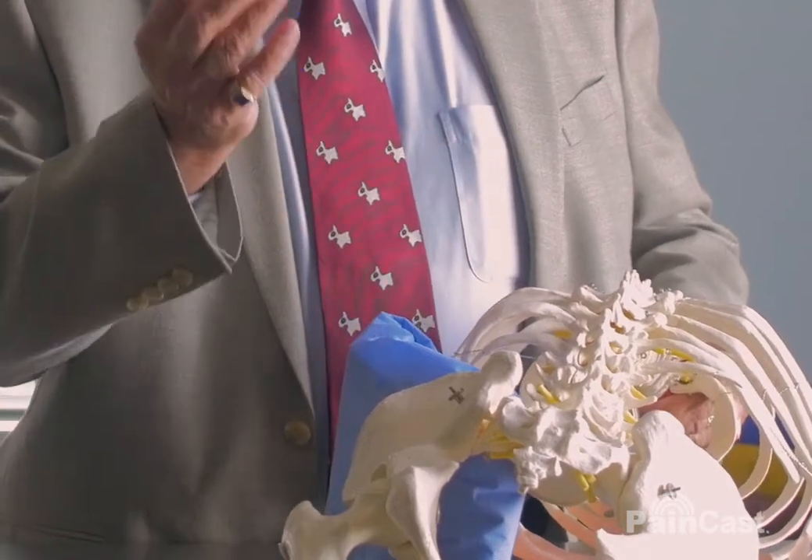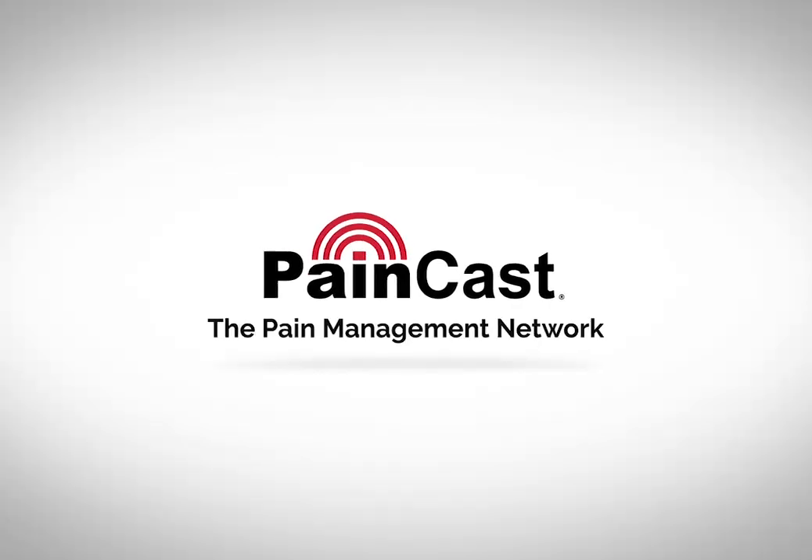And now you are freeing up the ventral epidural space, which is usually where the nerve is stuck down. That is the most common cause of back pain — the dura, the nerve root, is stuck to the posterior longitudinal ligament.